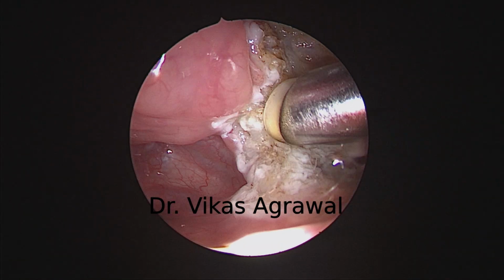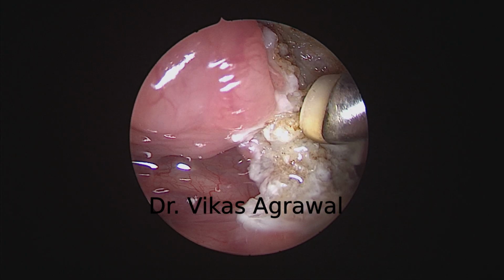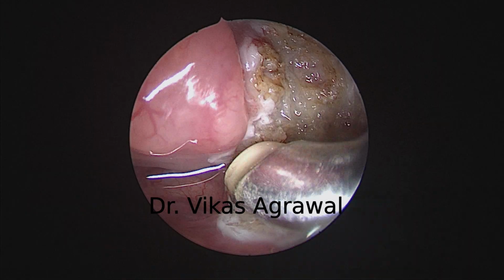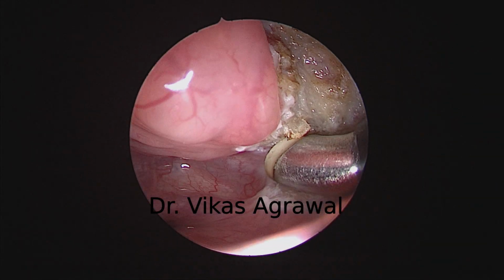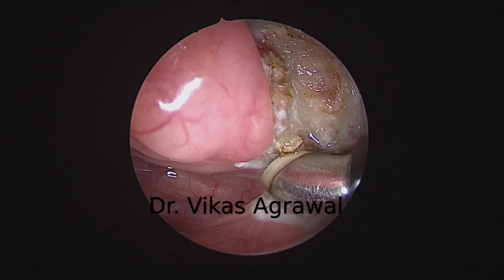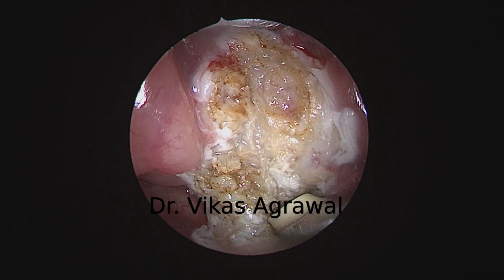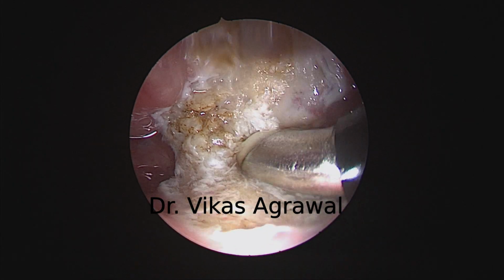Still a little bit of lymphoid tissue which I want to ablate very, very carefully. Coagulating again. That's the ligament. The whole ligament I'm coagulating, trying to remain in my correct position.